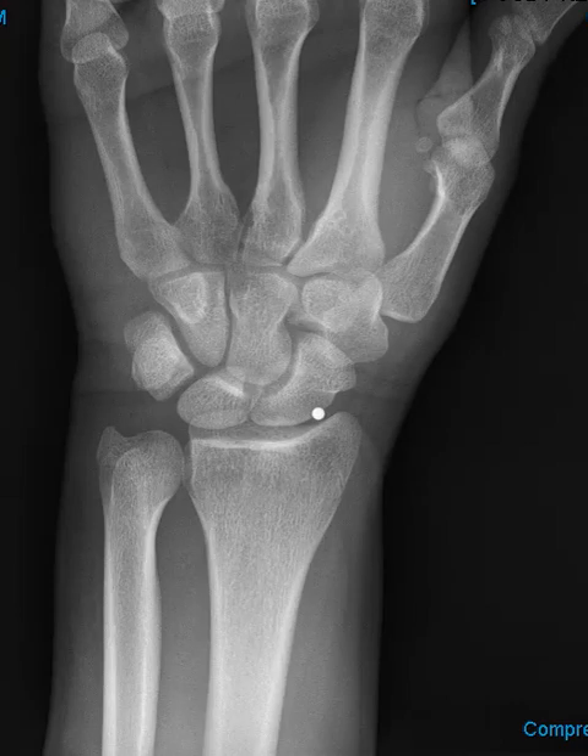Hello, this is Dr. Gaby from FirstSight MRI, and this is a short video to show how we do an arthrogram of the wrist prior to an MRI exam. We call it an MRI wrist arthrogram, and we'll start with the arthrogram.